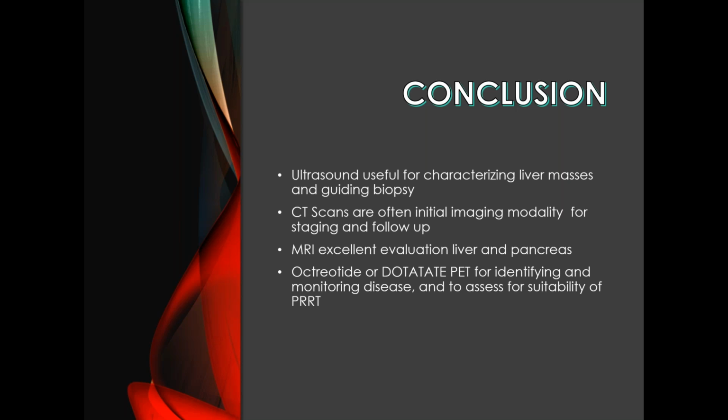They probably will end up maybe even using both, or they may do the gadolinium, not be 100% sure based on the information they have, and they might call the patient back and say, we're now going to give you Primovist. And it's basically, like you said, a way of troubleshooting, trying to figure out what that liver lesion is. So yes, that is another contrast.